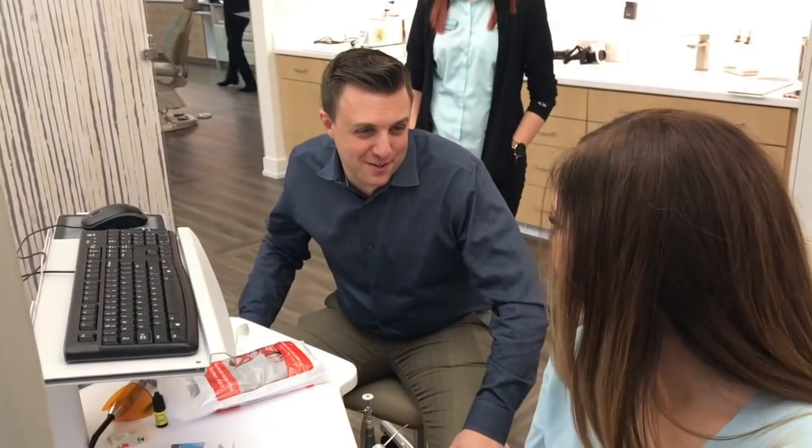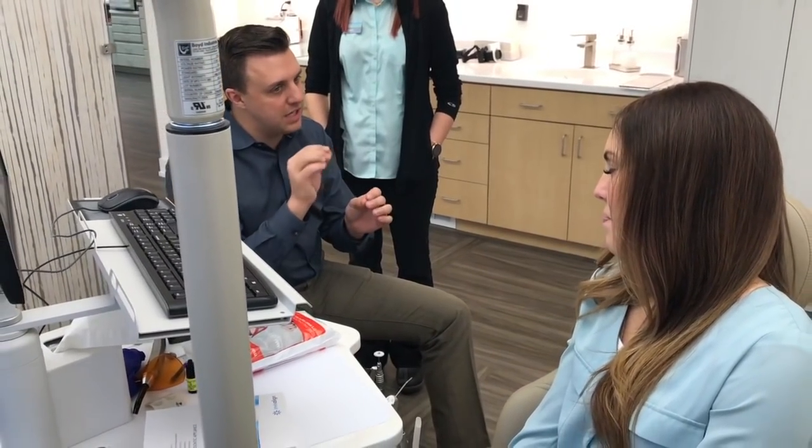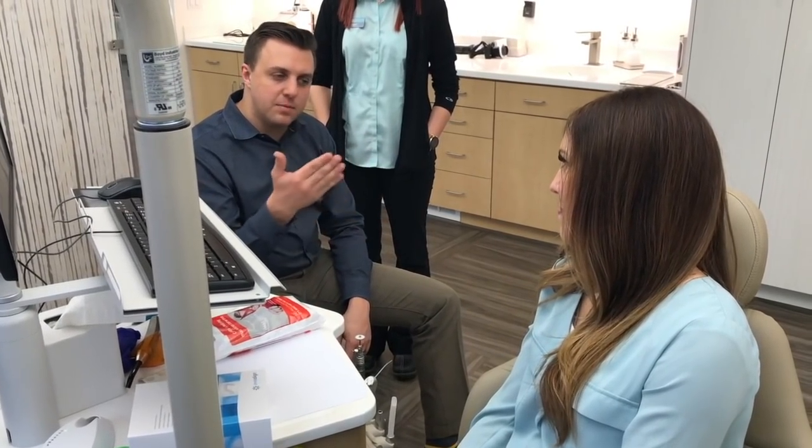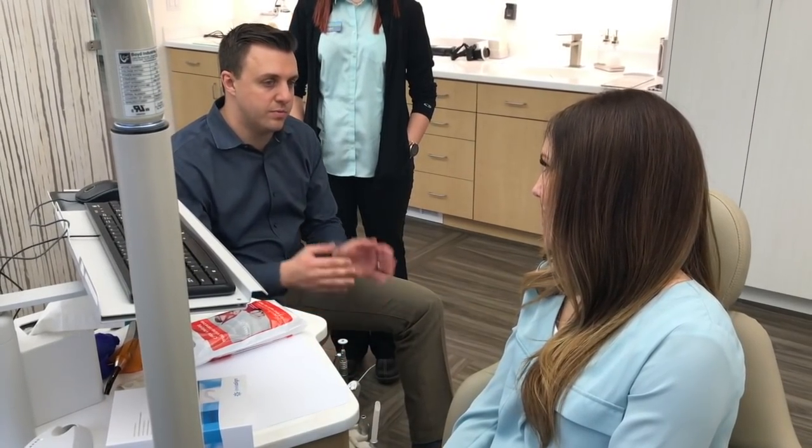So that's it — not too hard, right? I'm not in pain; it feels good. Day one I wouldn't necessarily expect a headache, but your teeth are going to be tender, just like a sore muscle. You remember when you had braces the first time — they put pressure on them and then you go to bite into something and you feel that pressure. That should subside over the next couple of days, and it won't be as intense as it was with braces. You may have a little bit of lip and cheek sensitivity, but each time you change an aligner you may have some soreness for a week or so, but not at the same intensity.